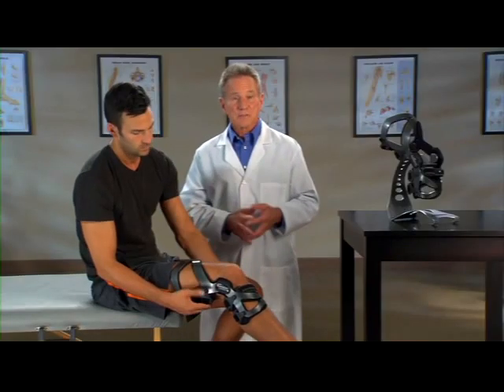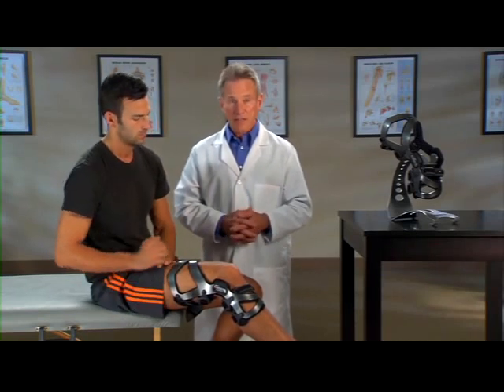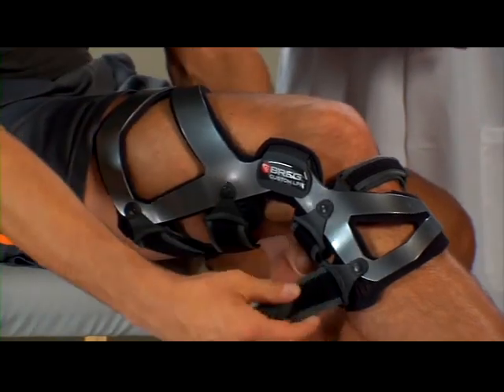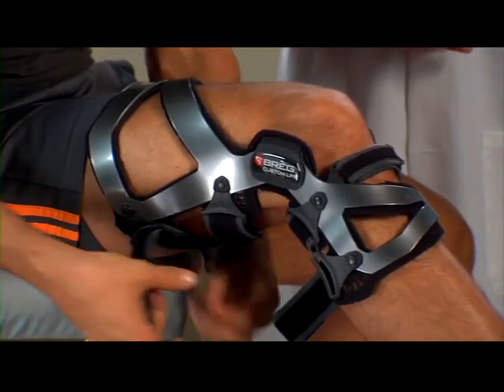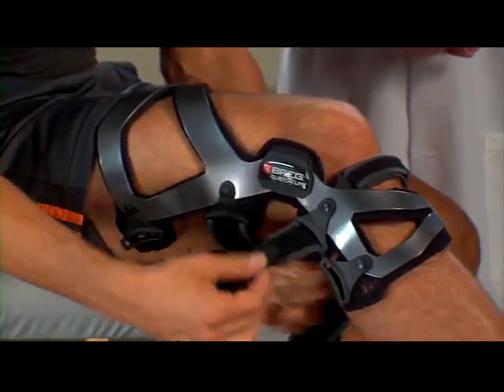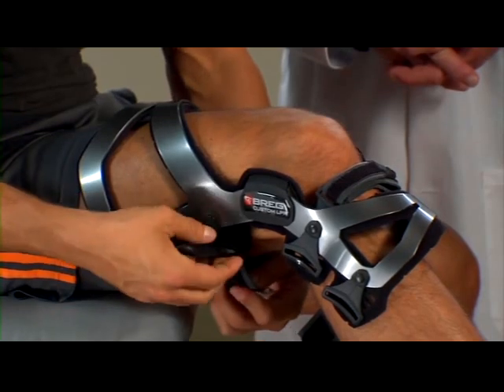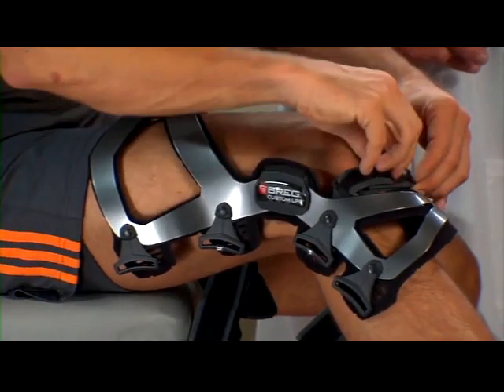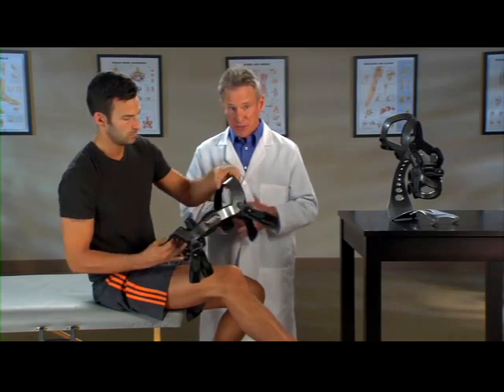For PCL-specific applications, apply all of the back straps first and the front straps last. To remove the brace, unfasten all the straps but just loosen number three. Then remove the brace and fold the hook-loop tabs back against the straps for easy storage.